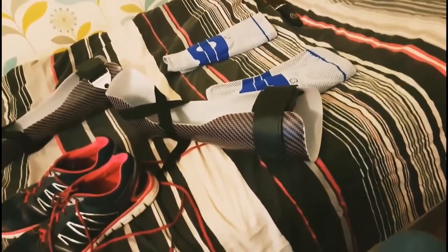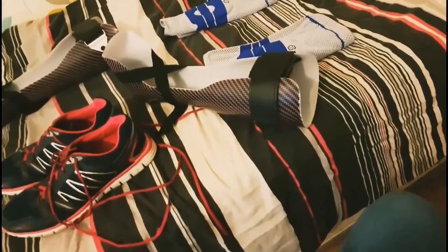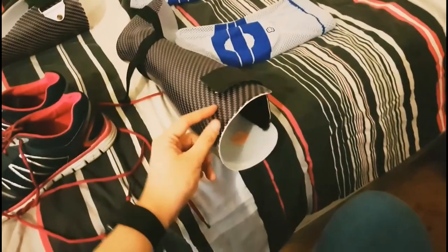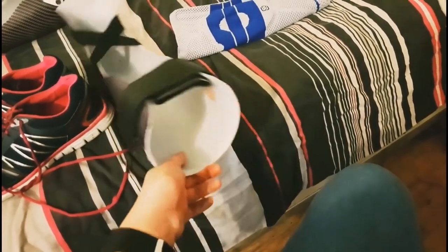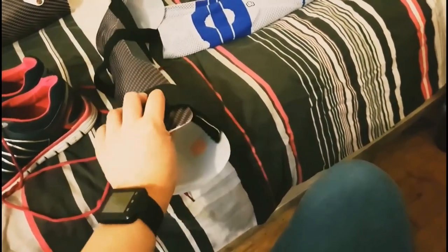What they do is they take a plaster cast mold of your leg and then make a model from it, and then they put the heated plastic over the model and then stretch the colour or the design on top of that, and then basically finish it up and polish it and put the straps on and whatnot.